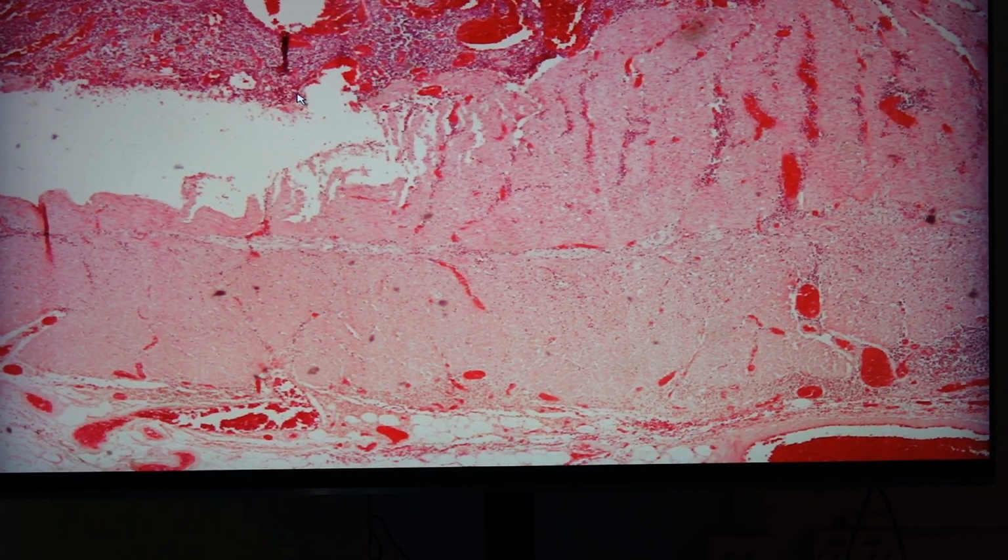The next slide is slide 109. This is ulcerative colitis. So another form of inflammatory bowel disease. Ulcerative colitis would involve the colon, the large intestine. So it can be seen in the rectum, it can be seen in the transverse, as long as it's in the colon.